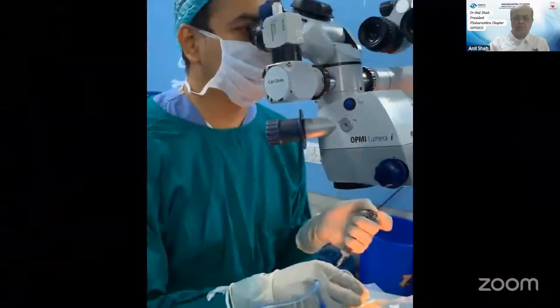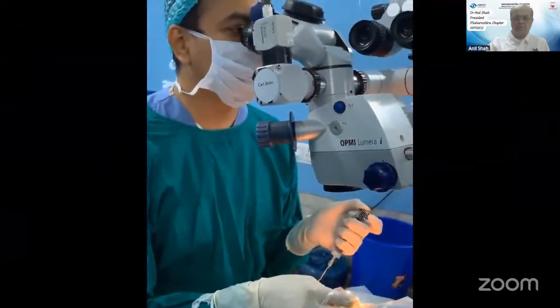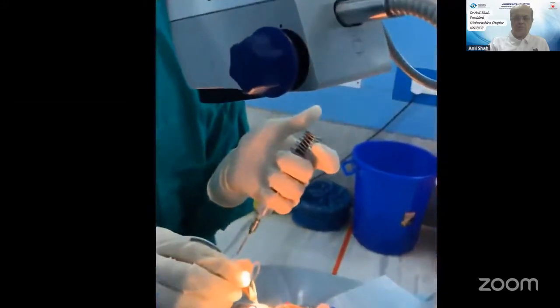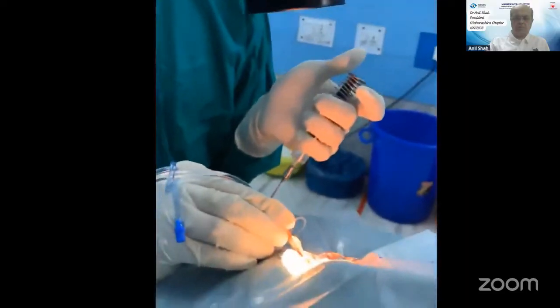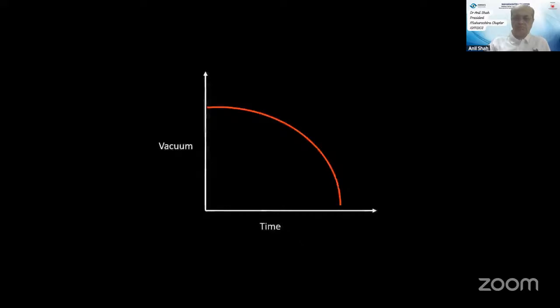With the spring in a state of compression, the Simcoe cannula is introduced into the anterior chamber and the thumb slowly releases the pressure on the flange of the plunger. The release of spring creates vacuum that allows the cortical material to fill the port, which is then manually stripped off its attachments and hence aspirated.